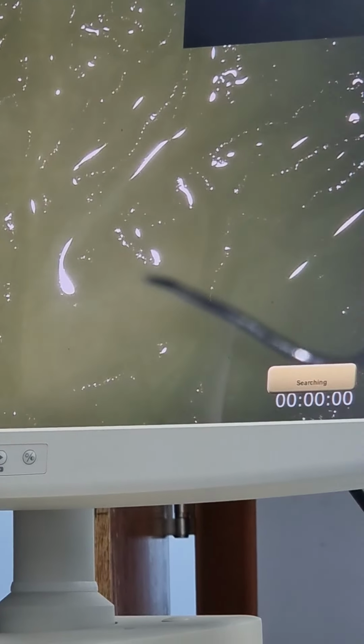Now once you get that, you take this instrument, a very important instrument for your endo. We call it an endo explorer. See here. This is different from the explorer which you have been using in operative, where one side was crooked in shape and the other side was for interproximal. Both sides of this have a straight sharp tip, and we call it the DG16 endodontic explorer. There is a specific name for this. What is the use of this instrument?